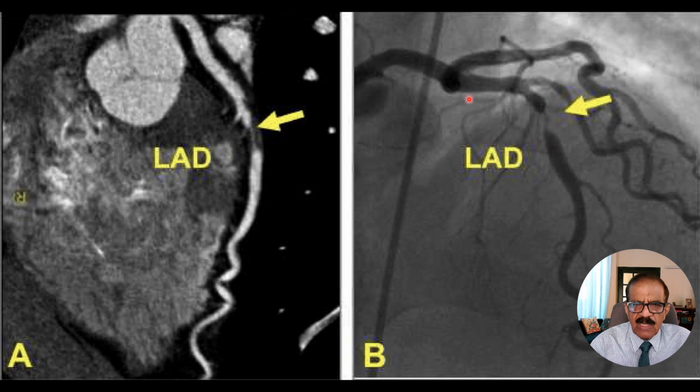This is typical appearance of normal angiography, catheter angiography, and you see this part. This is normal, and you have a big narrowing, or think about 90%, and then you have a normal. So this would be an indication for stenting or bypass surgery. I think stent probably in this case.